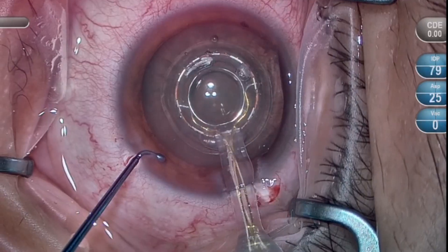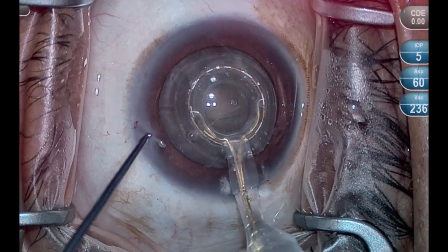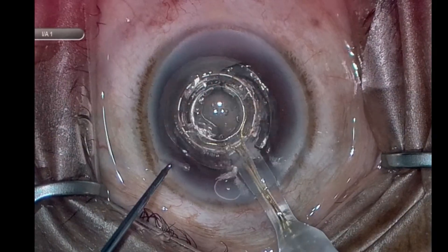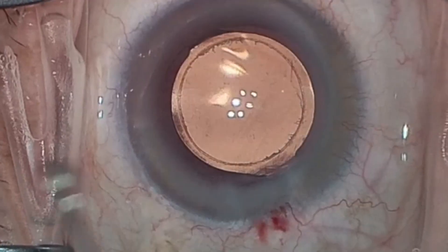To reiterate, good centration is based on pushrod management. Just like anything else, with practice, you become more comfortable with the technique. Zeptoe is a wonderful tool to ensure consistent, overlapping capsulorexis every time.